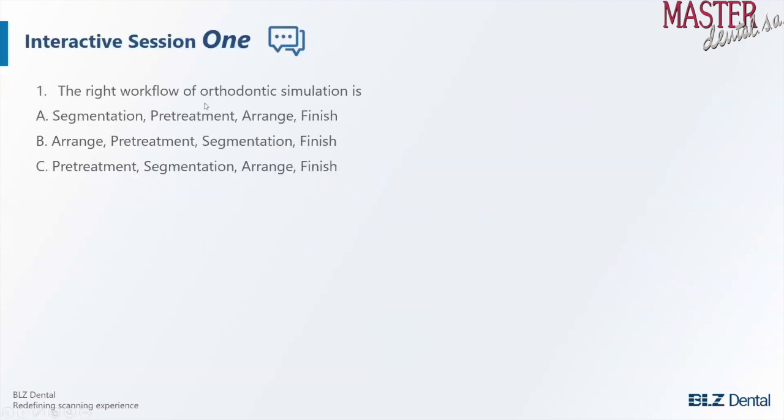So the first question is about orthodontic simulation. The first question, the right workflow of orthodontic simulation is A, B, C. Which one is the correct one? You can write down your answer at the comment column. Okay, C. Oh, too many people choose C.